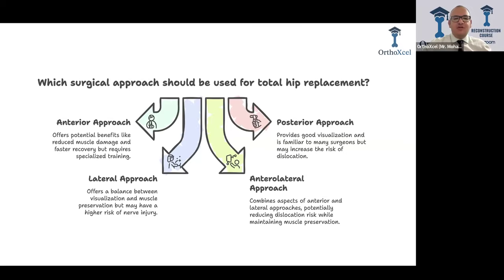With soft tissue repair, there are no problems, not a lot of problems with instability. We cannot ignore that the evidence says that regarding stability the order is anterior, then anterolateral, and then posterior. And posterior is the most unstable approach. But as I told you, if you do a proper soft tissue repair, it will be okay.